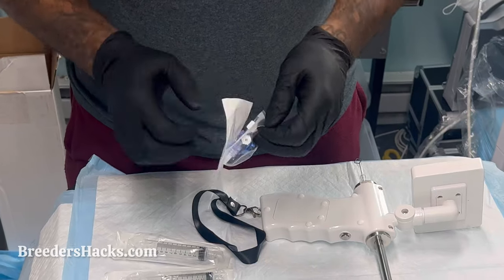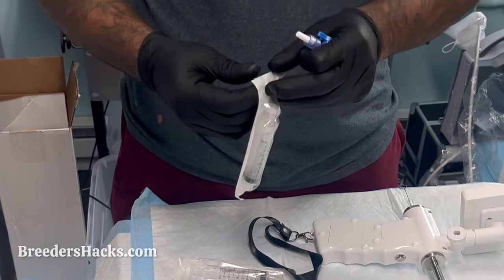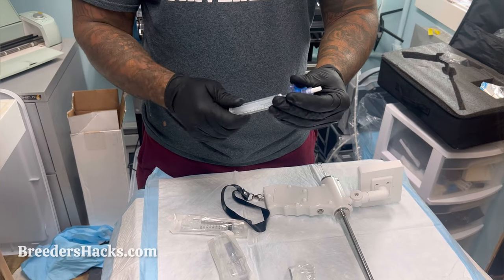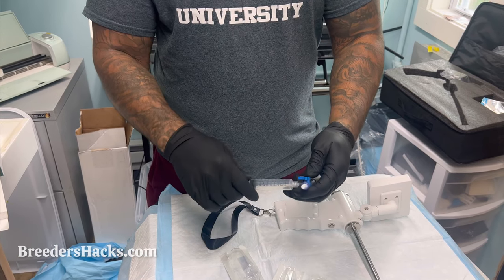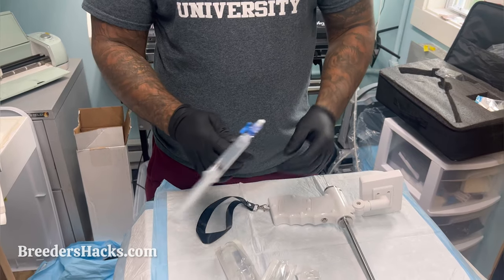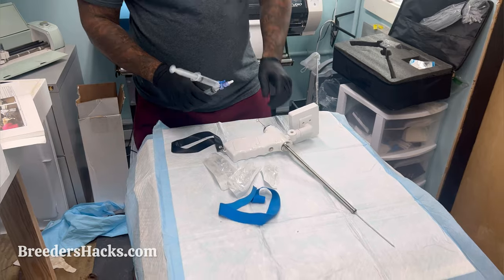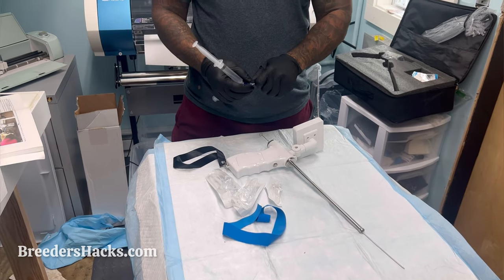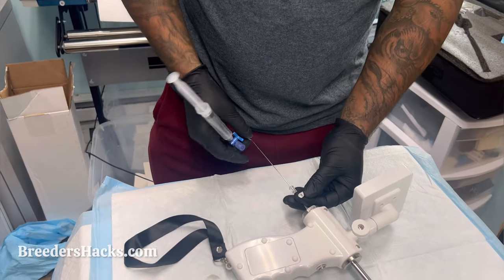Take your three-way AI valve and load up your syringes on each one. The first one is done, and the second one you fill with air so it's ready. Fill it up with 10 cc's — I probably won't use the full 10 cc's, but we have it accessible. Then we have our cap on here. When we're ready, I'll take this off, the metal rod will come out and we can twist it on — for now I'm going to leave it on.